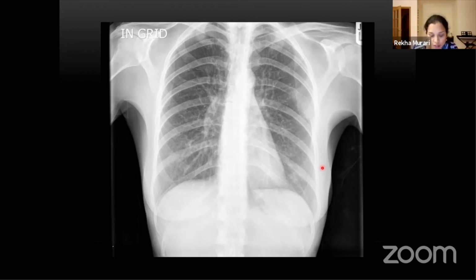Left lower lobe consolidation. Right, it's not left lower lobe consolidation, because I think I know what you're seeing. It looks like there's a triangle here, but actually this is a female patient. And always remember, if there is a female patient, you have to consider the breast shadow. So this is her left breast and the right one. That's what makes it look like a triangular opacity behind the heart, but it's actually not. And this is almost like a straightened heart border. There's no double border here.